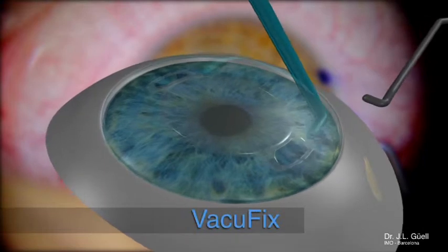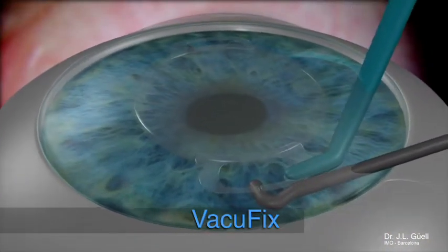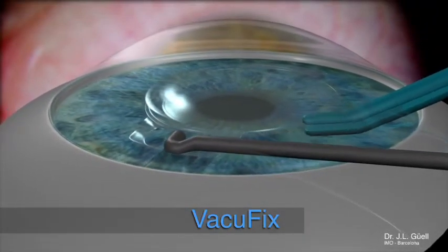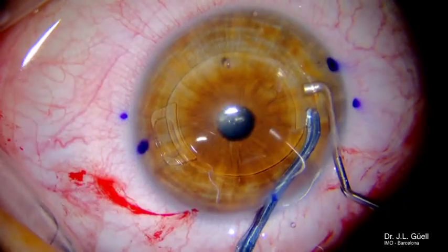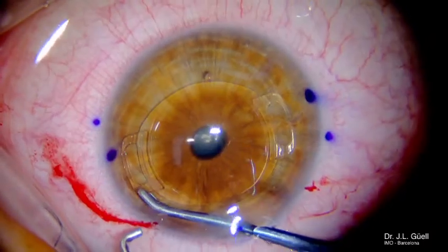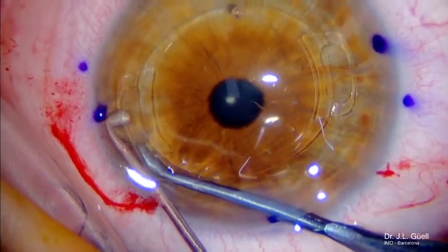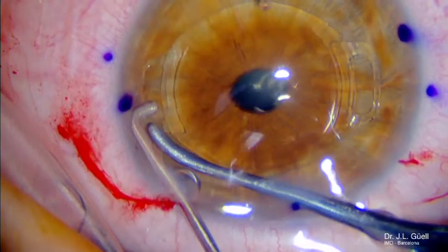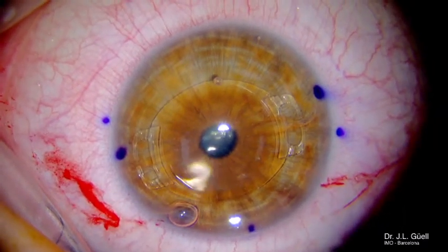Then, with this bimanual technique and using the VacuFix system, we will introduce a small amount of iris fold inside the claw, as shown in the diagram. You can see the same maneuver under the surgical microscope. One of the main advantages of using this VacuFix system is that there is no small rotation once we introduce the iris fold inside the claw. This small rotation must be taken into account when we use the enclavation needle instead of the VacuFix.